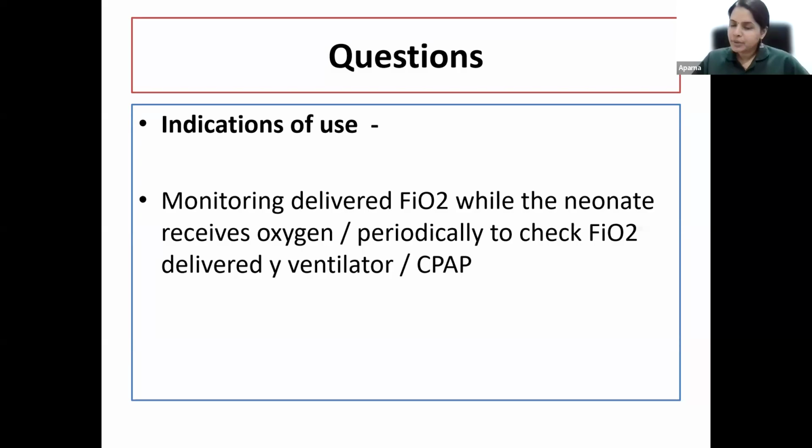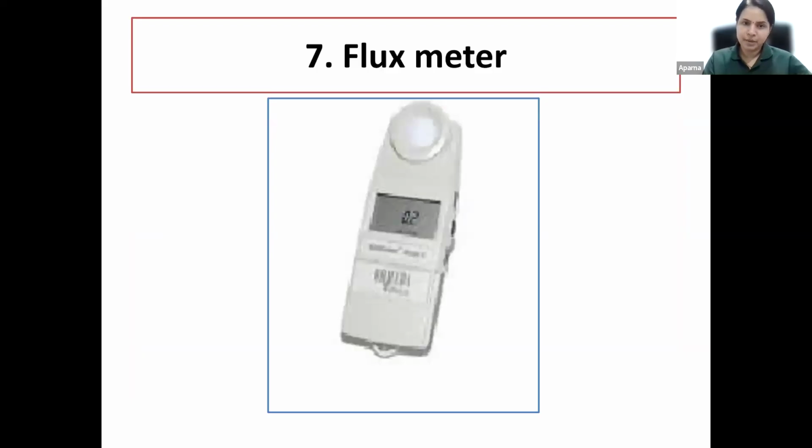Indications for the use of an oxygen analyzer while using CPAP: to monitor the FiO2 while the neonate receives oxygen, and to periodically check the FiO2 delivered through the ventilator or CPAP.